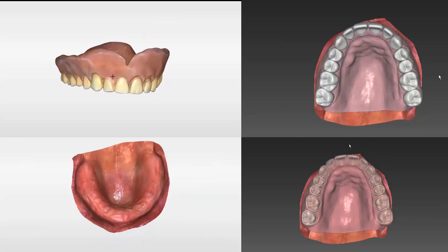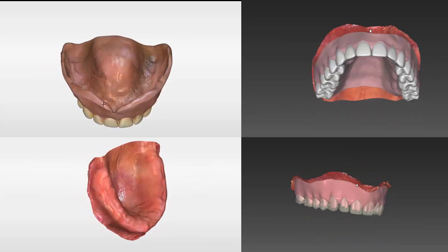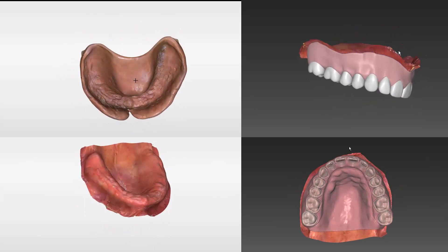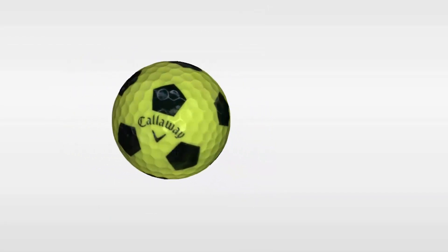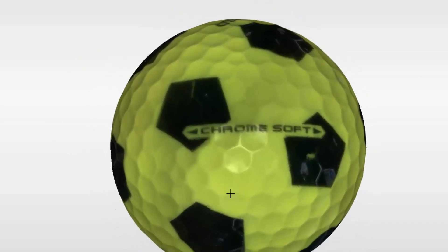Not only can the PrimeScan handle routine restorations and even full arch scans, its accuracy opens the doors to additional full arch applications like edentulous ridge scanning for dentures and even denture duplication. The PrimeScan software is so incredibly powerful it can even scan a completely spherical object with no real 3D variations, like a golf ball. The applications are endless.